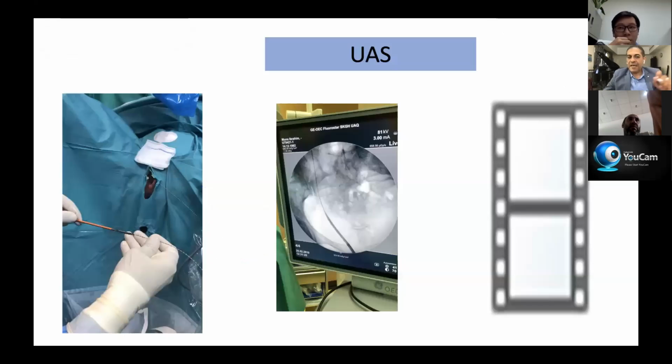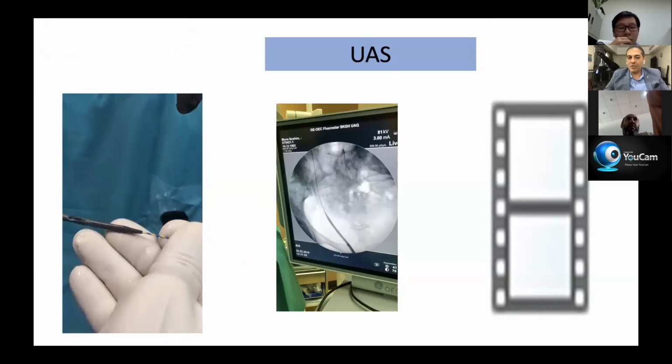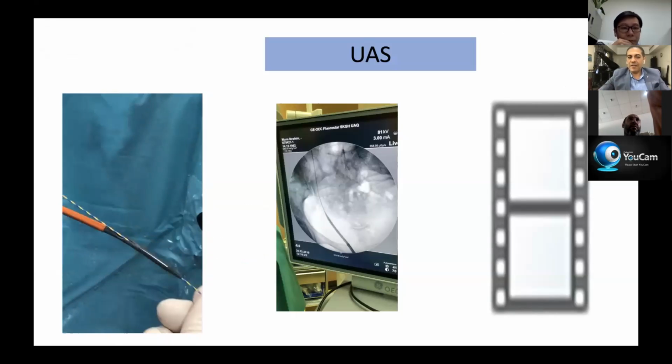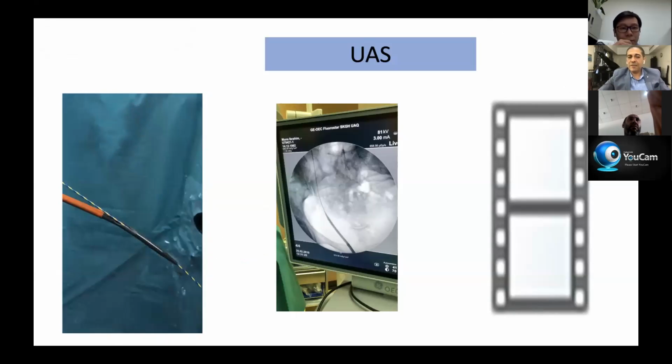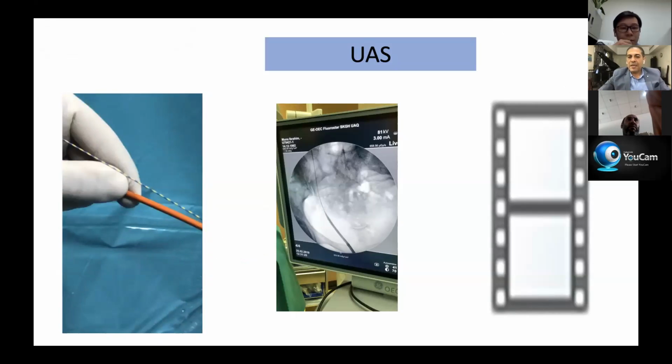And again, I show you the safety guide wire here, how we are using that one. It saves a lot of time. It goes from outside the sheath, so you can go and the access sheath will be outside the scope.